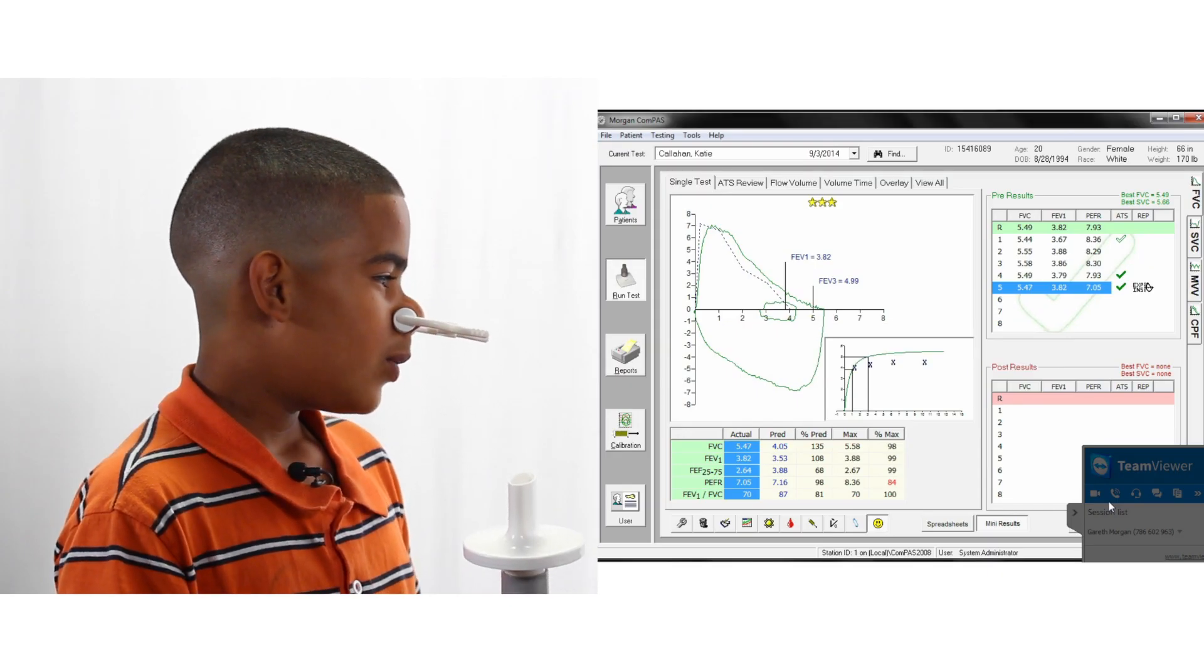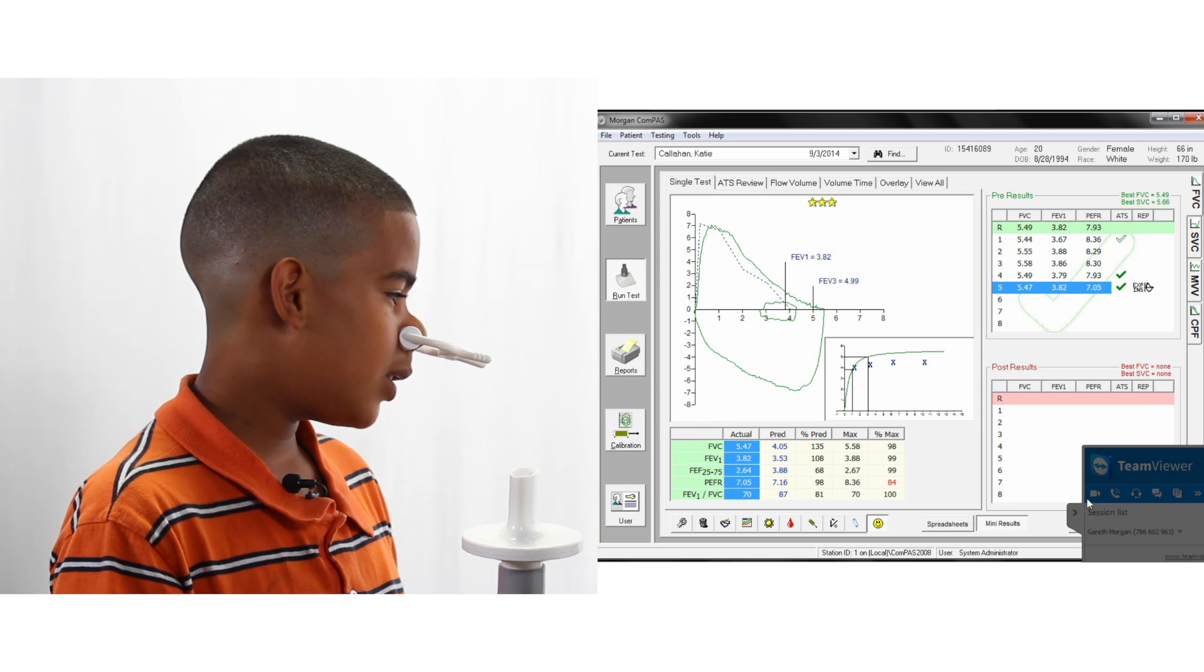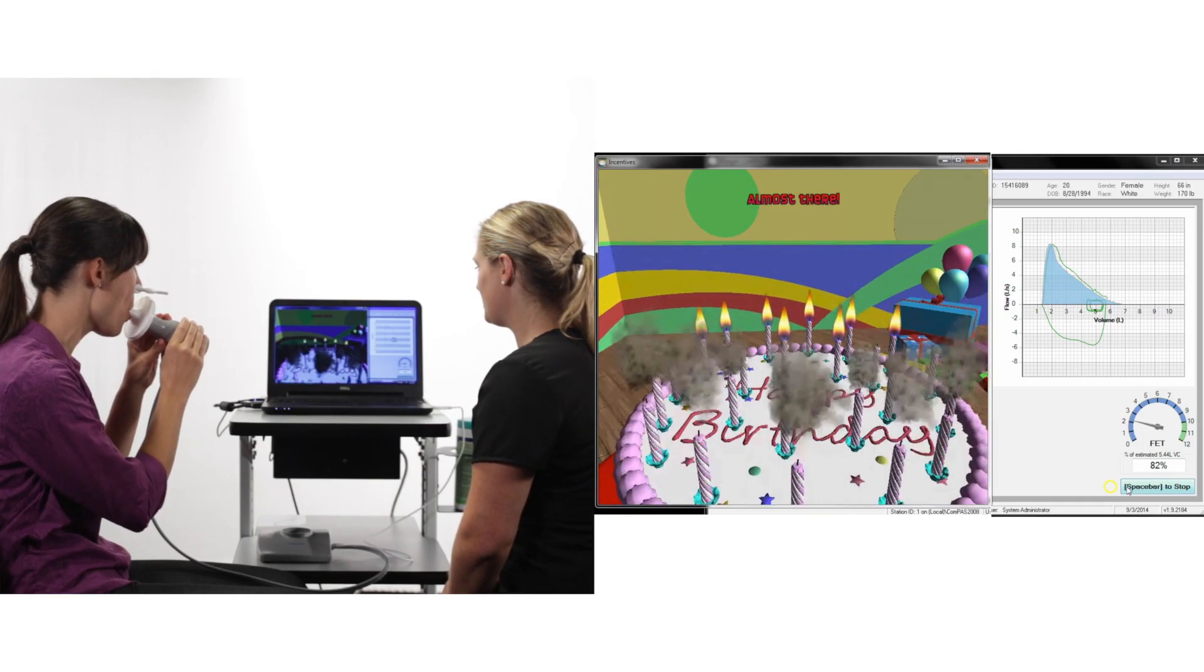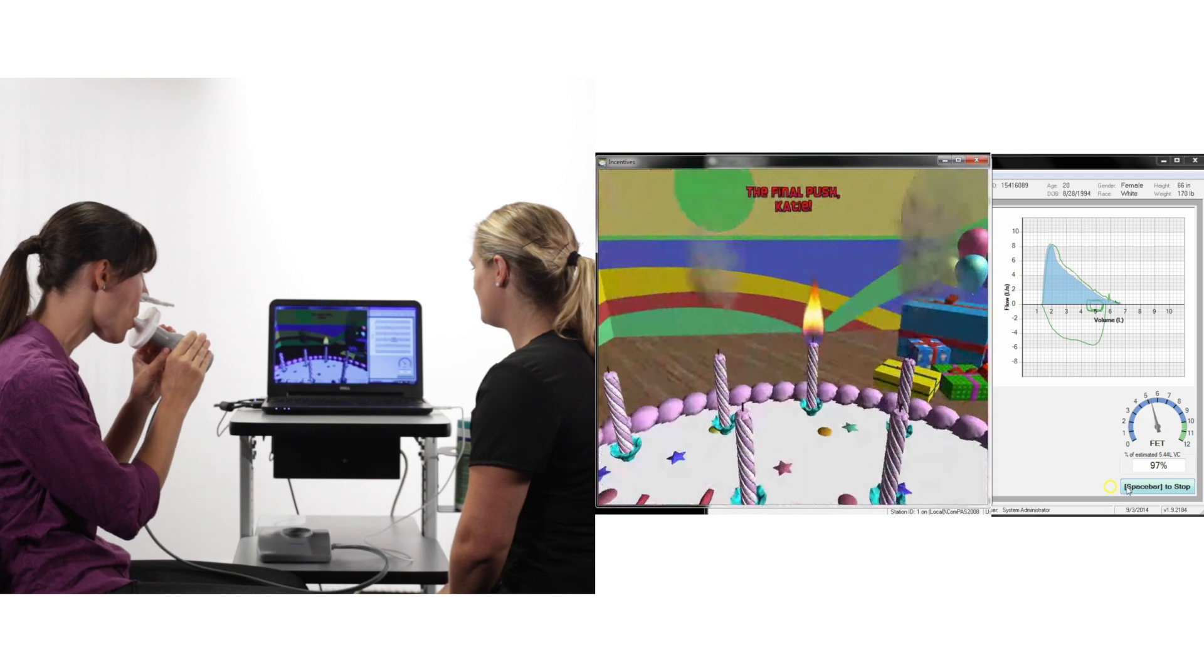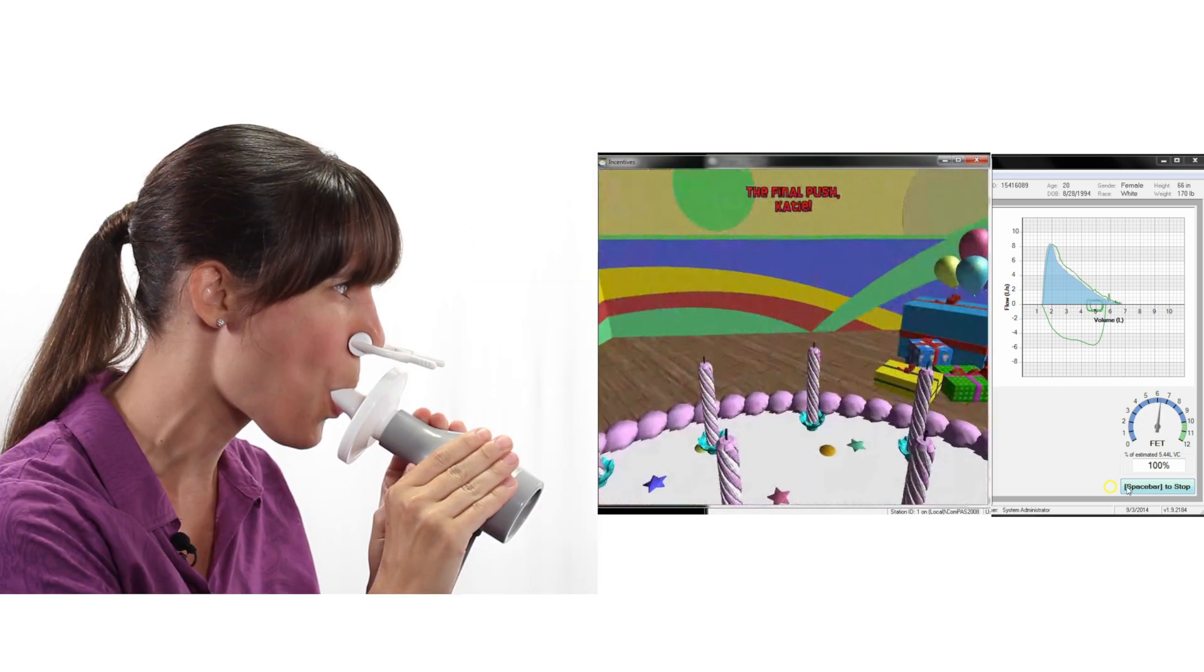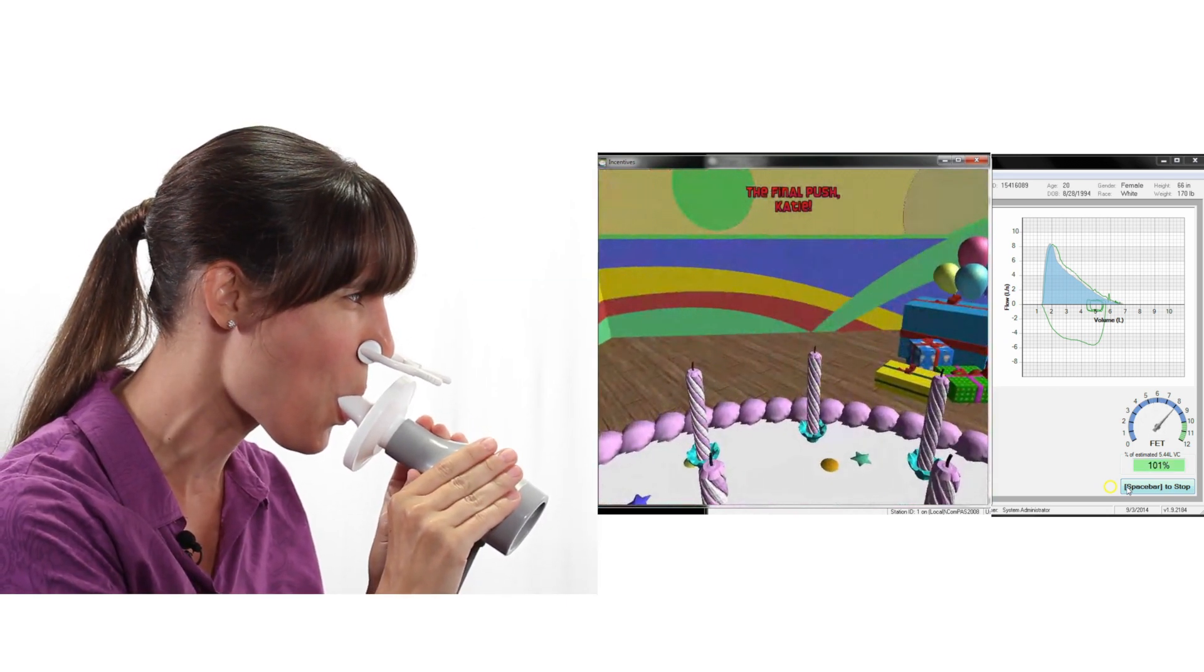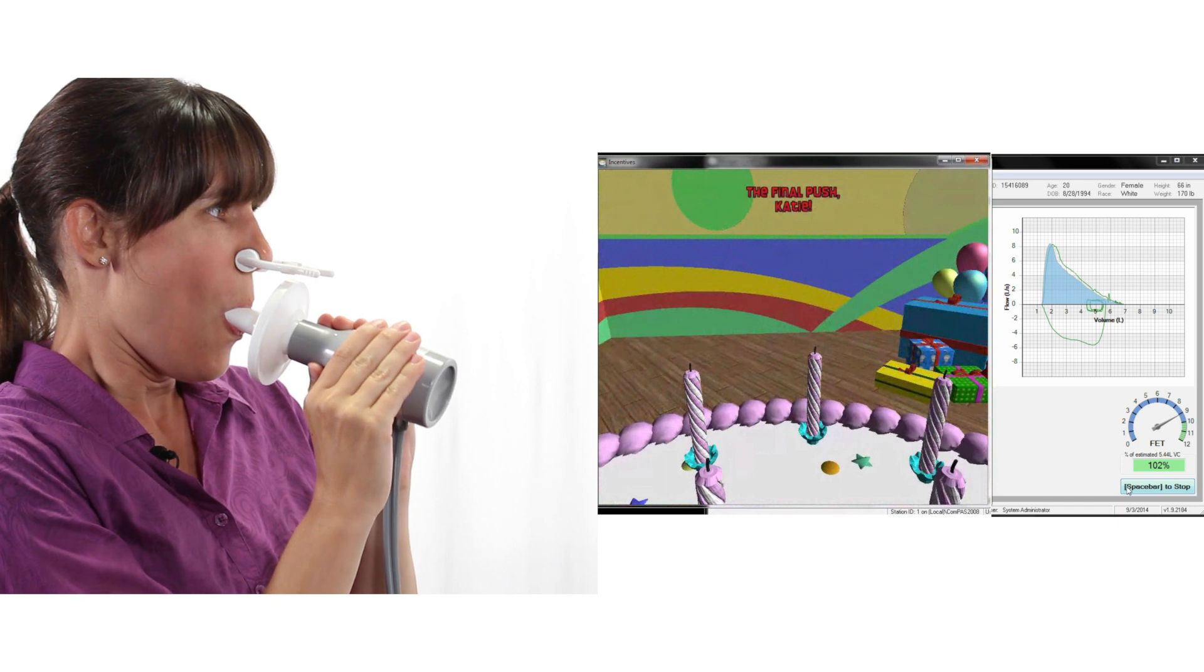The incentive screens can pop forward and be sized for optimal display. Clicking and holding the top bar of the animation window will allow the user to move position to anywhere on the desktop.